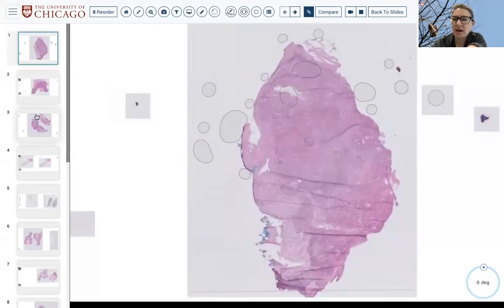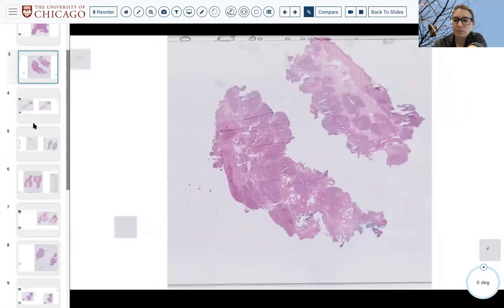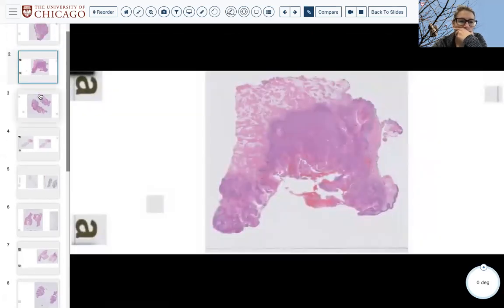All right, questions, comments? Grossly, did it look like that other piece that permanent was? Because I know sometimes the tumor isn't always obvious grossly. So did they think grossly? So this was obvious grossly. I don't know what prompted exactly which slice to be frozen. I don't know if this was maybe a mirror image of the one that was frozen. And as you cut into it, it just got closer.